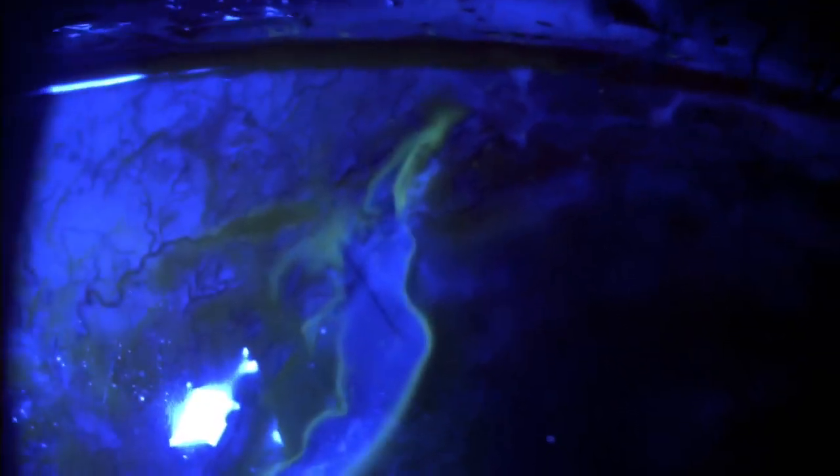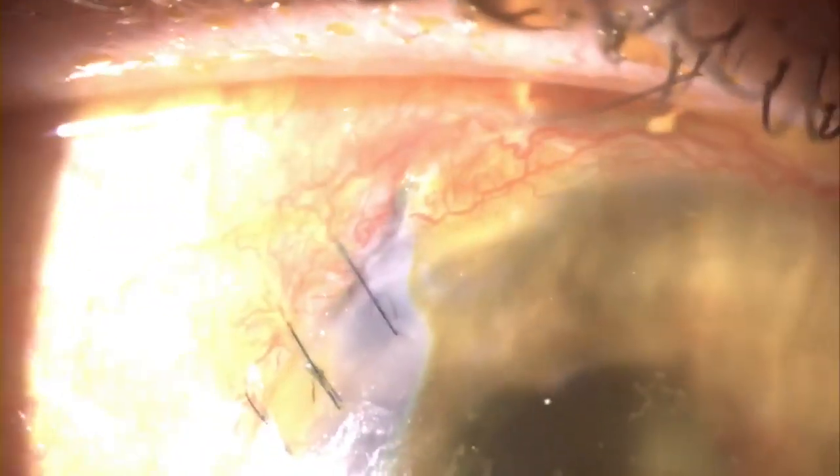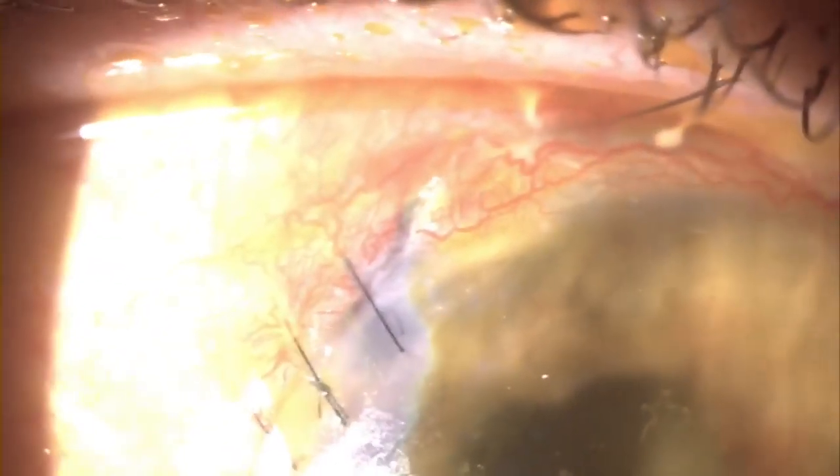So you instill 1% fluorescein — 1% is really important — and there we see the waterfall effect. You can see a trickle of fluid coming out through the wound where there's a leak there.